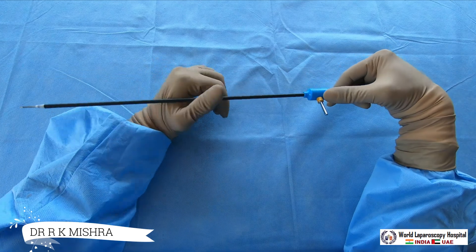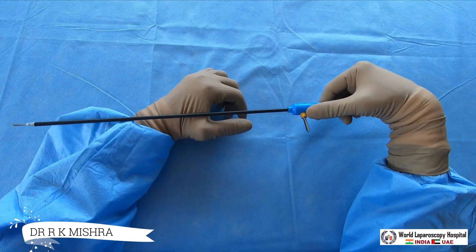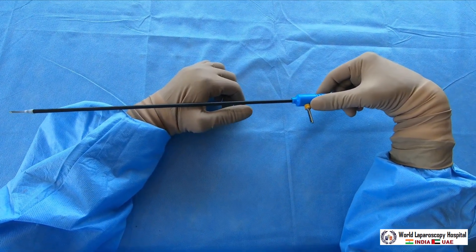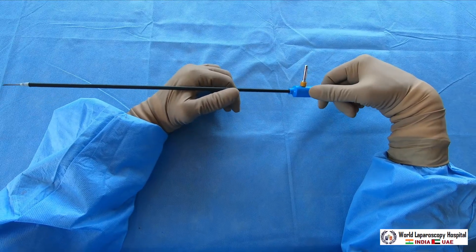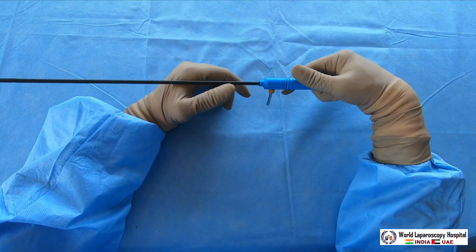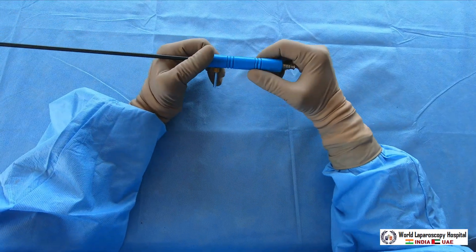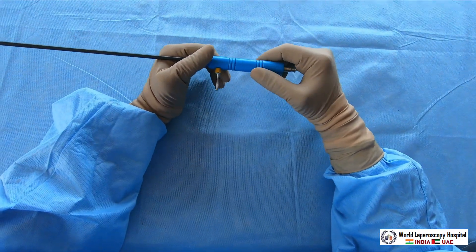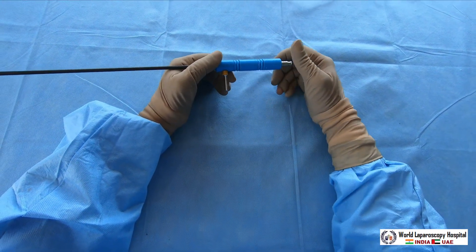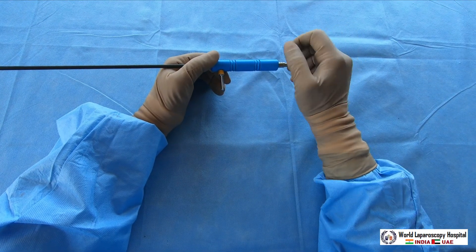The aspiration needle is very useful whenever you want to aspirate an ovarian cyst, aspirate the gallbladder, or aspirate a mucinous cyst. It is also sometimes useful to find out the CBD when you are doing CBD exploration and you have a doubt.